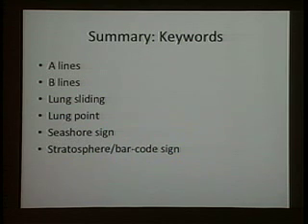As you're doing your echo, let me tell you what I normally do for the sake of getting proficient with this. Every time I do a heart case, and I'm scanning my neck as my resident is getting ready, I usually do two things. One, I scan my neck just before I even prep the area, because I want to see if my patients have very little IJ or it's thrombosed, whatever. I don't want to be prepping one area then finding that the IJ is gone or thrombosed. So I preemptively check both IJs before I do anything.